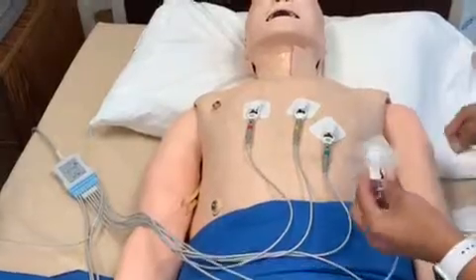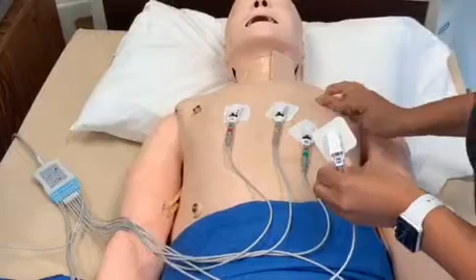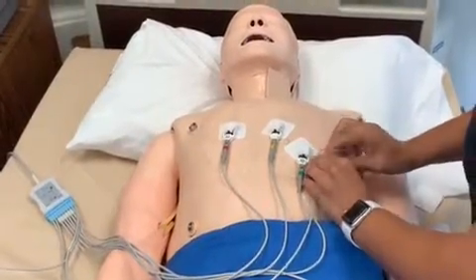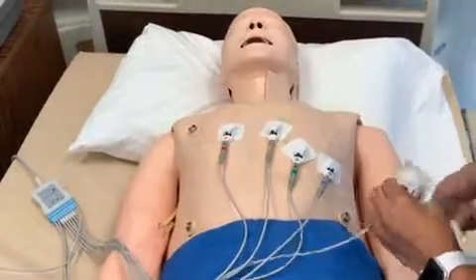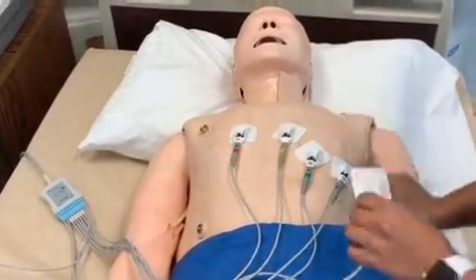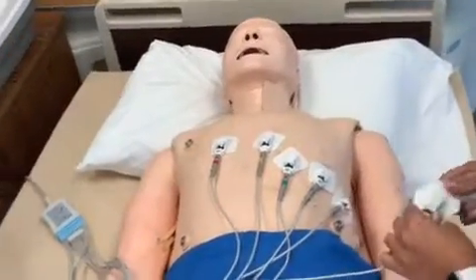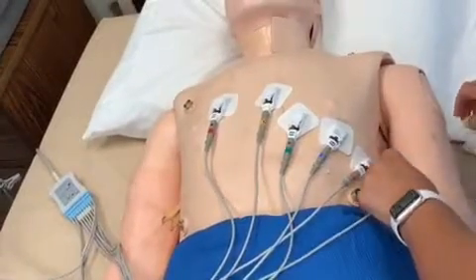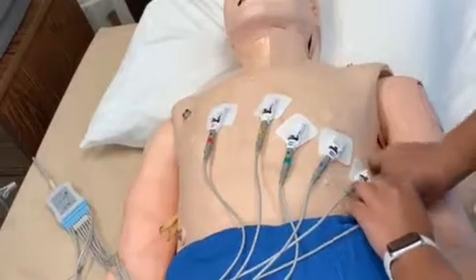V4 goes in the fifth intercostal space at the mid-clavicular line. V5 goes level with V4 at the anterior axillary line. Axillary line. V6 goes level with V5 at the left mid-axillary line, directly under the midpoint of the armpit. Mid-axillary line.